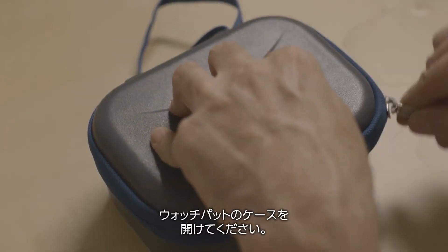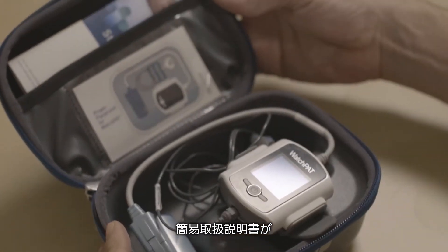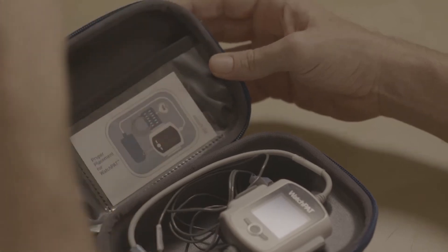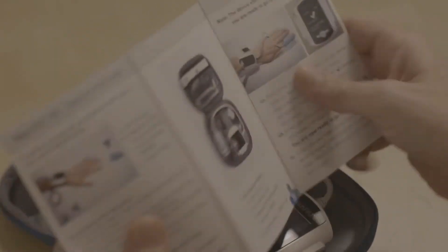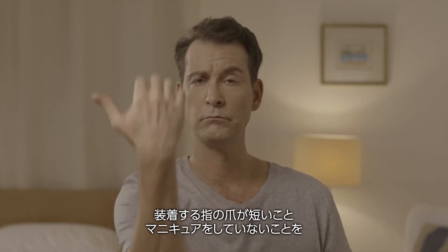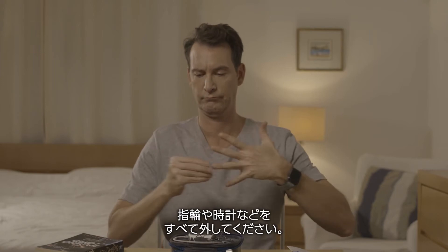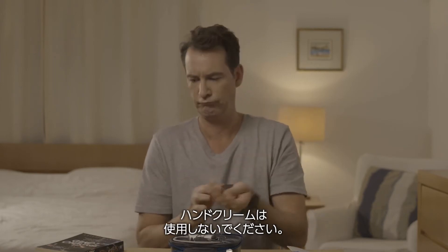Open the WatchPAT case. You will find a helpful illustrated guide in the side pocket. Be sure that the nail on your test finger is cut, trimmed, and without nail polish. Now remove all jewelry and accessories, and avoid hand cream.